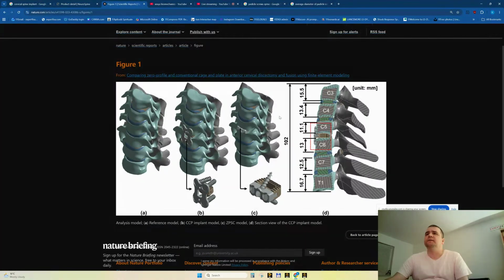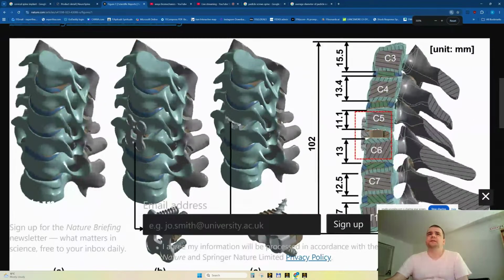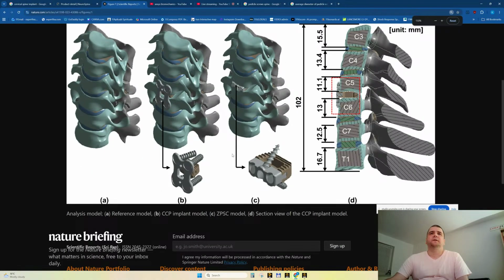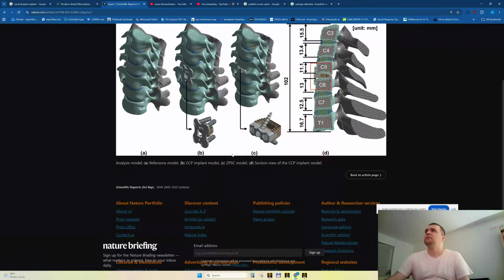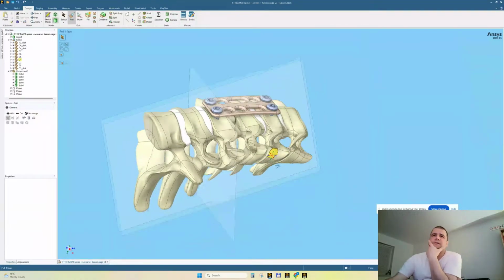Oh, yes, they have these cartilages. Look here, what I was talking about. These brown spots here. These ones, I'm talking about this one and this one. And my question will be if I have time to make them. Let's see how hard it will be to make this.